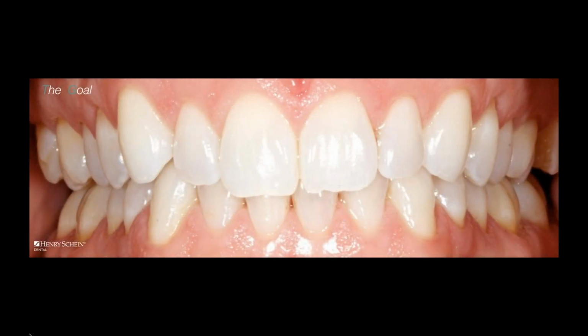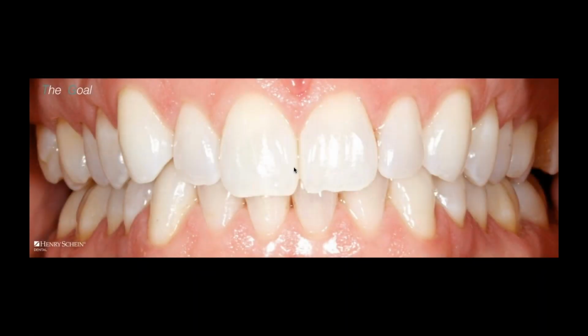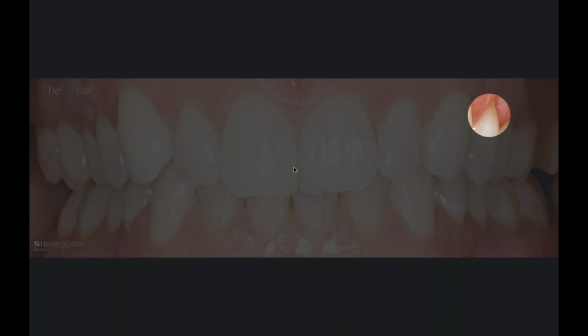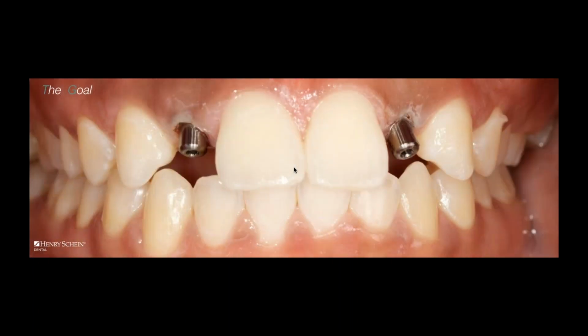She's got confidence. Now, you and I look at this and we say, heavens, there is a chip on the incisal edge of tooth number 9. There's a millimeter of recession on a bicuspid. There are rotations in the canines. There are asymmetries in the free gingival margins. We pick the smile apart. There are 20 things wrong with it. But the reality is this patient is happy and healthy. The real question is, how do we get to this vision of health? How do we recreate nature, or the illusion of nature, when a patient presents to us like this?